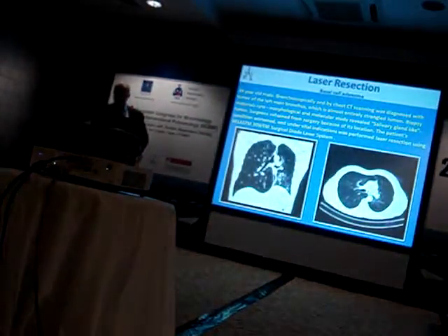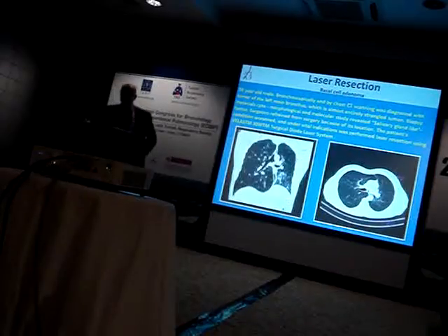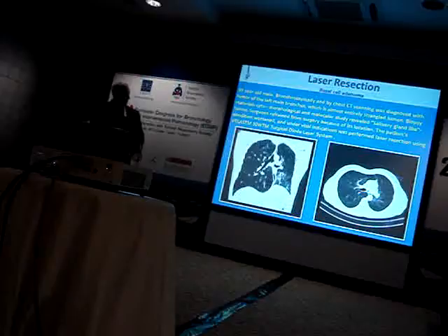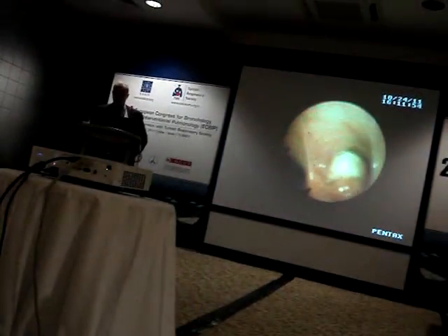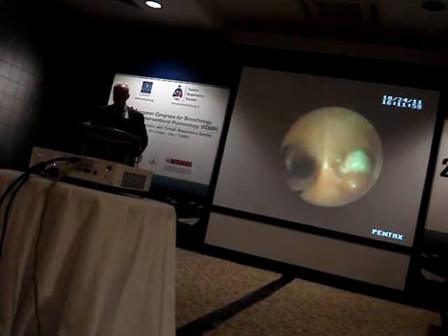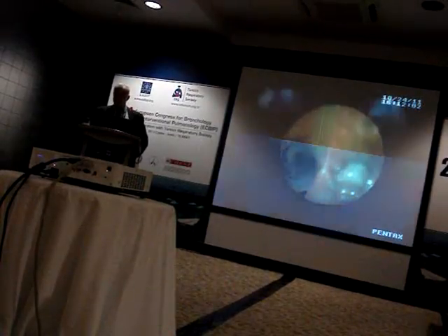Another case, this is a case of laser resection in basal cell adenoma, a 39-year-old male. The CT scan showed occlusion of the left main bronchus. During this bronchoscopy, we performed a biopsy, which revealed a salivary gland-like tumor, basal cell adenoma.